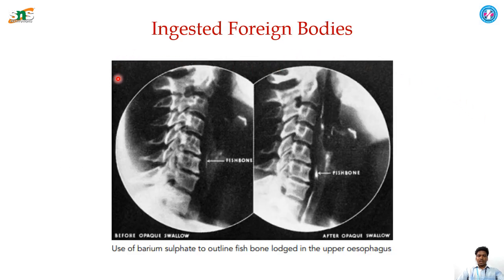So here is an example of ingested foreign bodies, where a fish bone was unintentionally lodged in the esophagus. By use of a barium sulfate procedure, the barium swallow procedure, the outline of the fish bone lodged in the upper esophagus is seen.